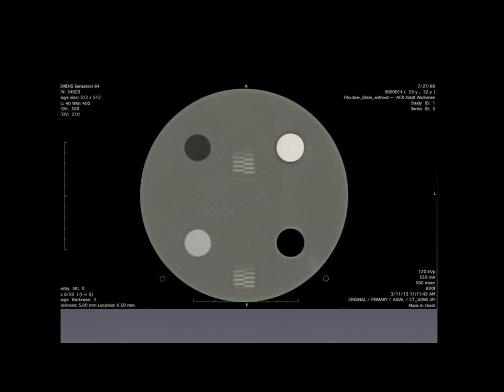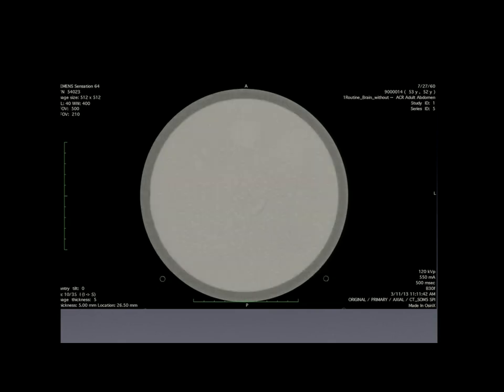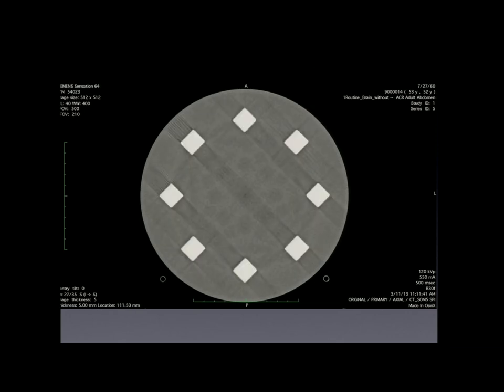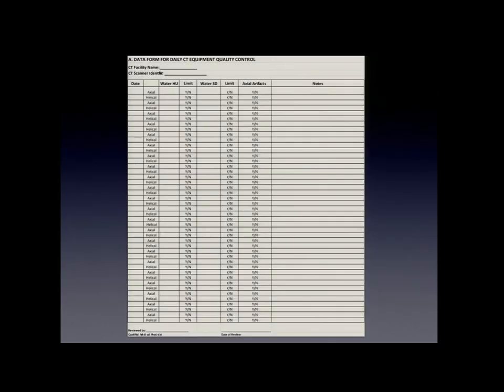Okay. And there it goes. When we do it helically, you can see that that ring moved from slice to slice. So that's showing that the detector, as it moves, is being changed as it goes around. So you have an axial one that gives you a ring, and then as you go around, you get the helical. So you can see that that's a detector.